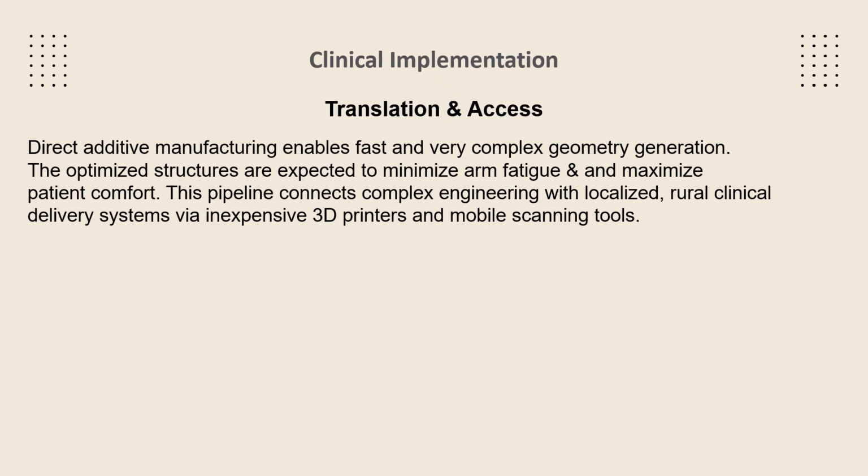These generative optimized structures have large void spaces and are not suitable for subtractive manufacturing like CNC milling, but they are suited for additive manufacturing. Direct 3D printing enables us to manufacture these geometries without the tooling cost or production complexity.